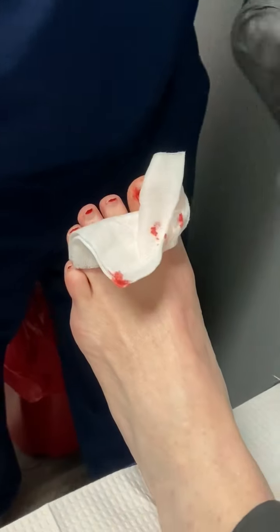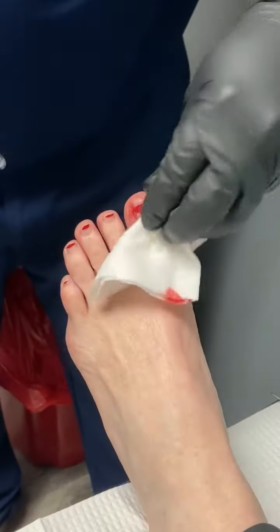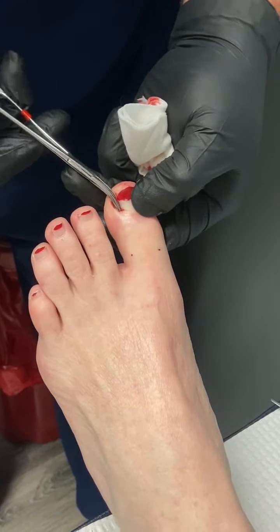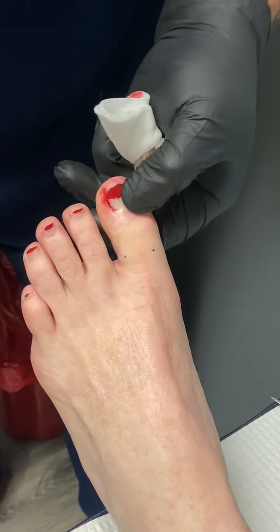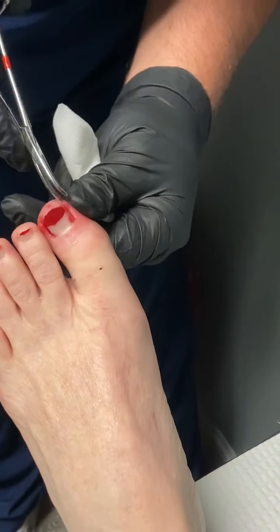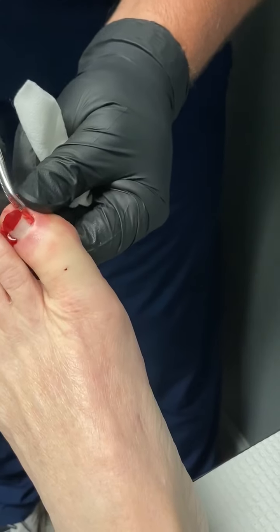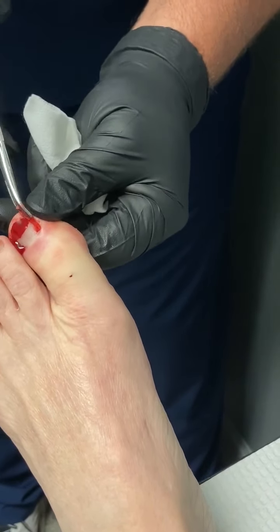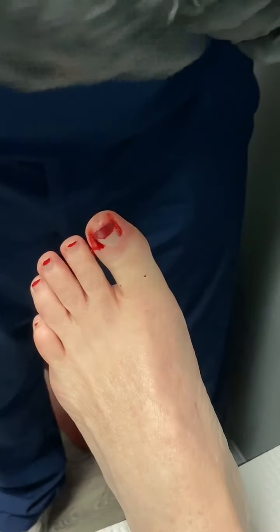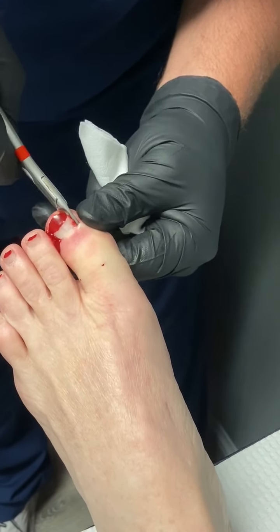And then we grab it with a hemostat. Pop it out. Grab it. That one's still stuck. A little bit more of a release here — there we go.